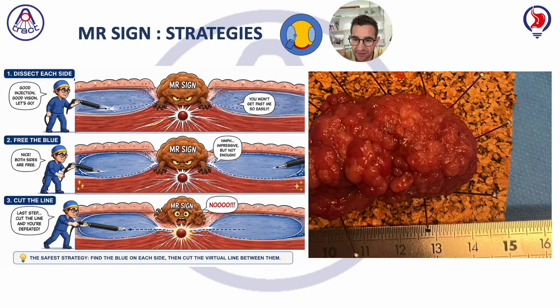But nevertheless, even if you try to precoagulate, most of the vessels are very difficult to detect within the fibrotic area in the center of the lesion.